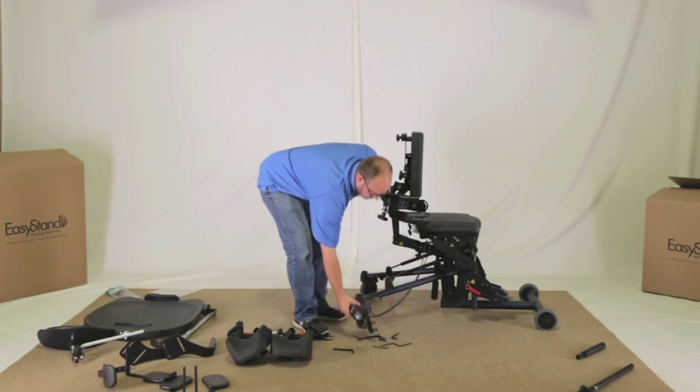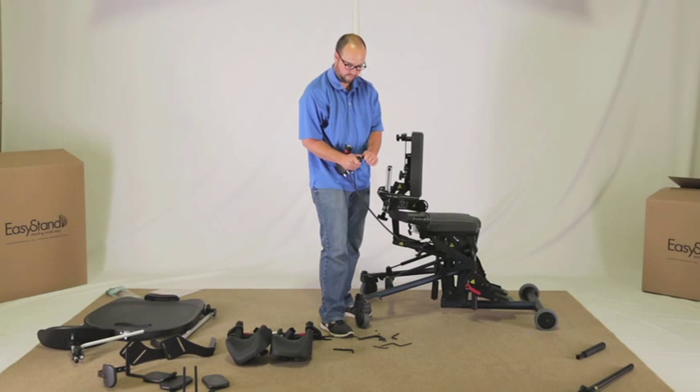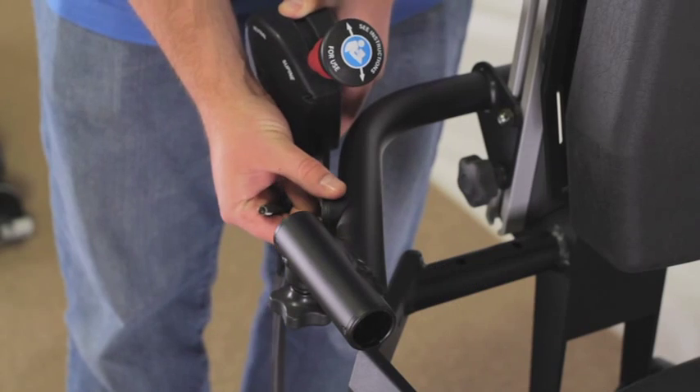If the supine option was ordered, remove the two bolts, coved washers, and nuts from the supine controller. Place the controller onto the unit making sure the cables are not twisted and are free from getting tangled.